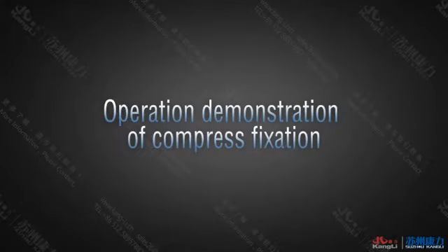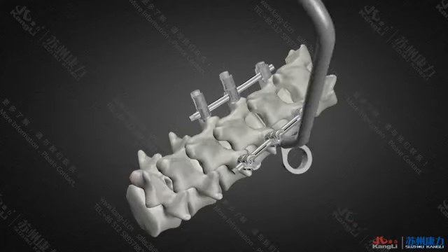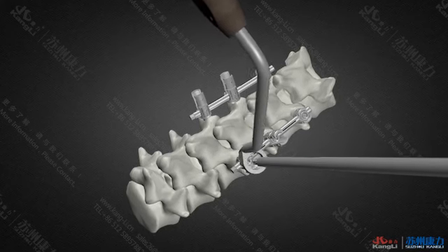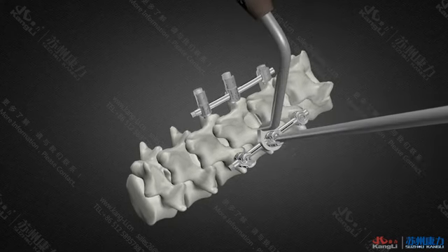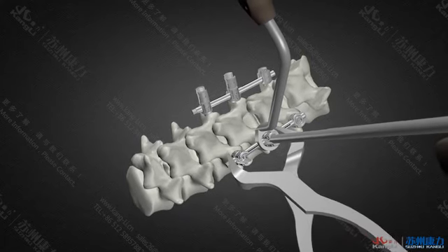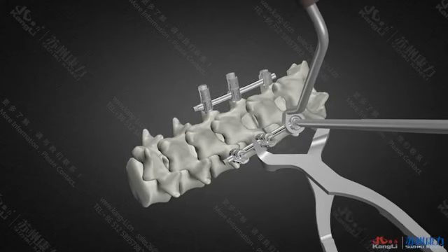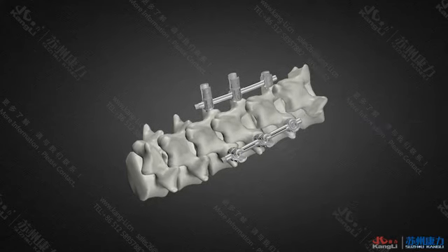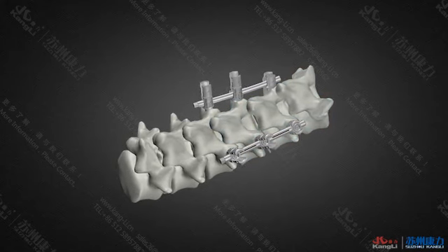Operation demonstration of compressed fixation. Use the T5.3 wrench and anti-rotation device to fix the plug screw on one side, while the plug screw on the other side is loosened. Place the compress clamp. Compress slowly to the proper state, then wrench the loosened plug screw and finish the compress fixation. Repeat the above to finish the operation of the other side.